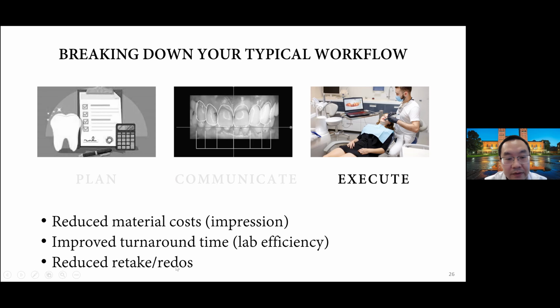So we talk about reduce, improve turnaround time. So if your patient has to get out of town for a wedding or something in the next week, can't wait the 3 weeks, right? This allows you to deliver something much faster, right? Reduce material costs. You don't have to basically use the impression materials anymore, right? That saves your material costs. And then shipping costs, sending the cases into the lab, reduces the cost too, right?